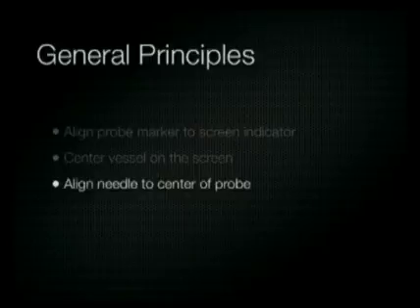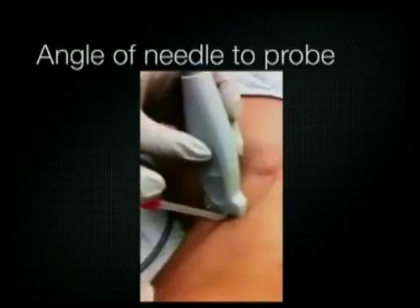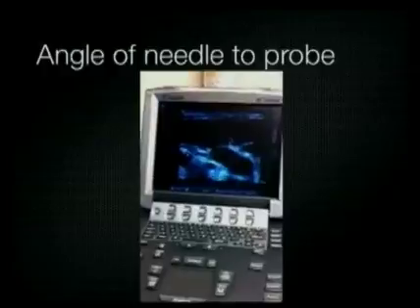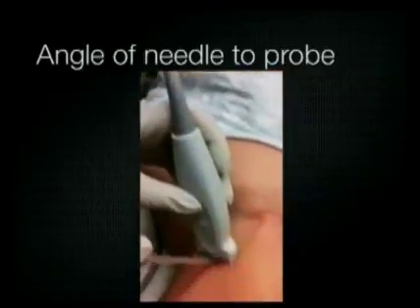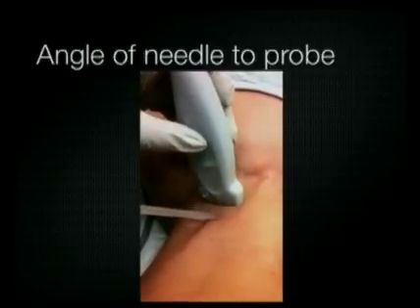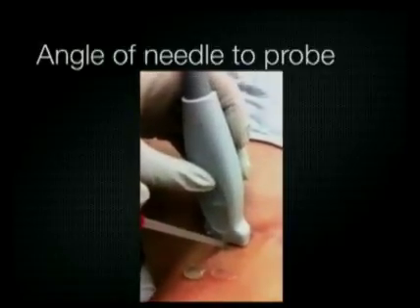Next, you want to align the needle to the center of the probe at at least a 45-degree angle, as demonstrated in this clip. It's also important to be mindful of where the clavicle is, because if you penetrate the internal jugular vein too close to the clavicle, you can cause a pneumothorax.